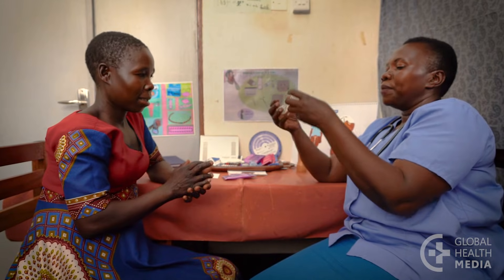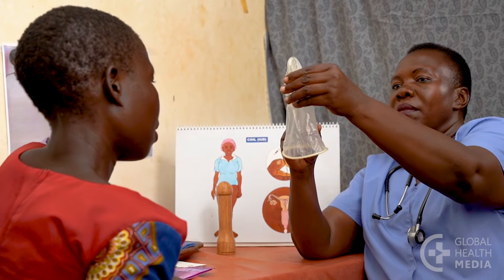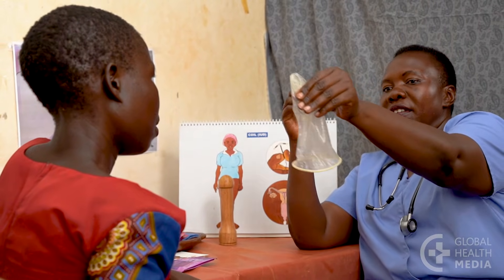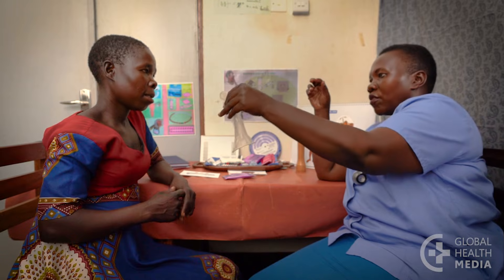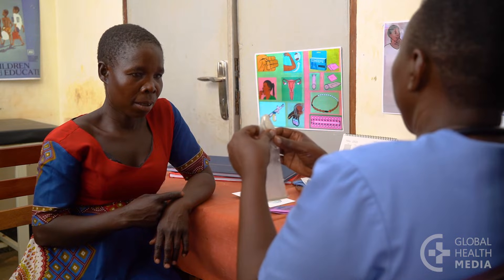Show her the flexible rings at both ends. The closed end goes inside the vagina. Advise the woman to put the condom inside before the man's penis comes near her vagina. She can put it in up to eight hours before she has sex.